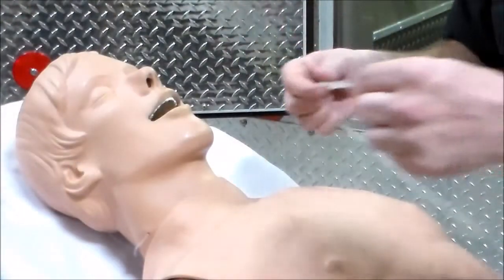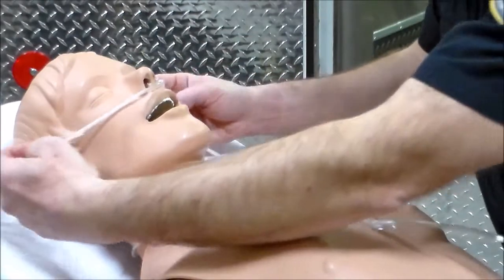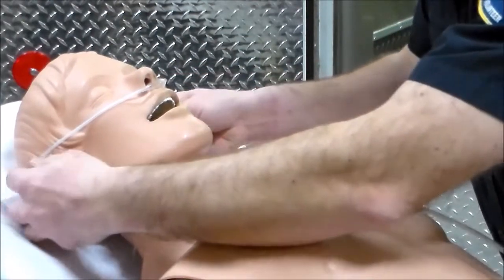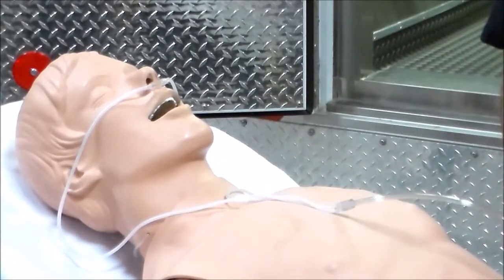With our nasal cannula, we insert the nasal prongs first, then loop around the ears, and tighten it up snug underneath the patient's chin. And we are now flowing oxygen to the patient.